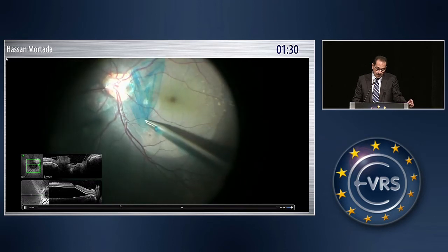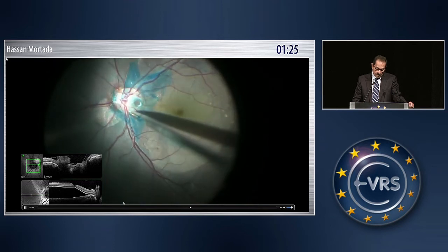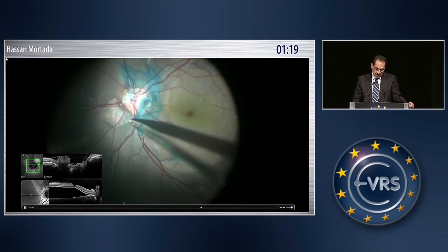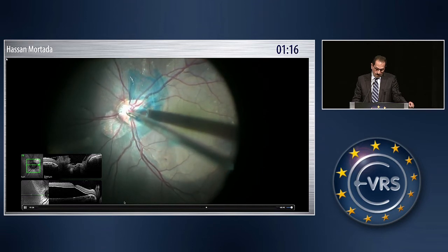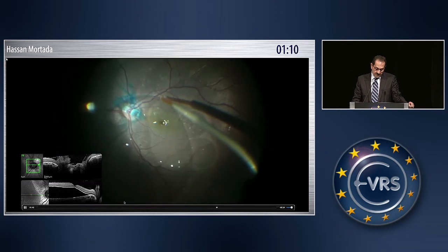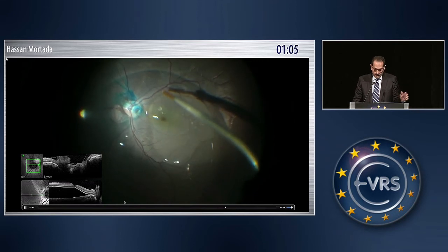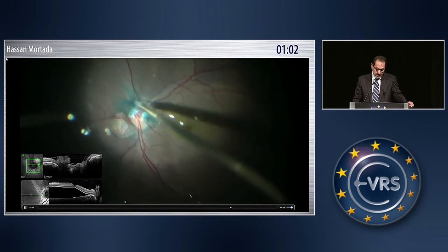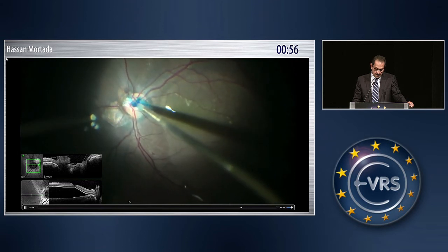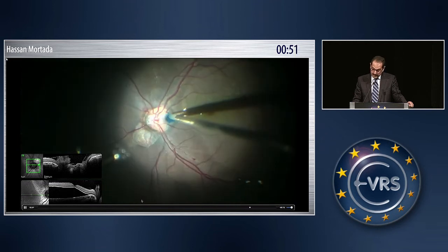In order to place it accurately inside the optic pit, sometimes I inject PFCL. You can see that it is a big optic pit. PFCL is injected away from the optic disc, leaving the bubble increasing. And with the use of this tissue manipulator, I start to put the ILM inside the pit.